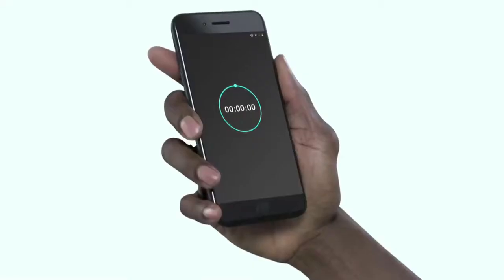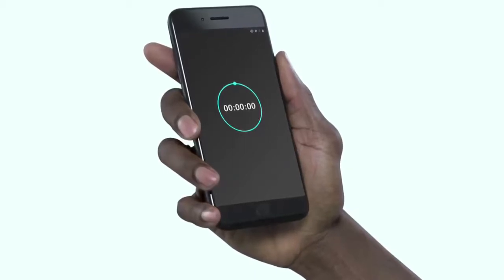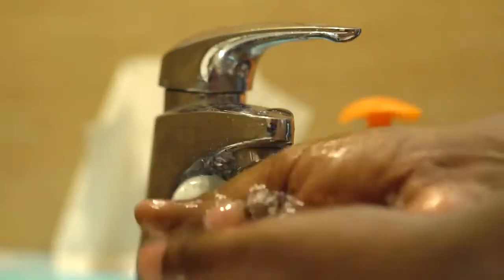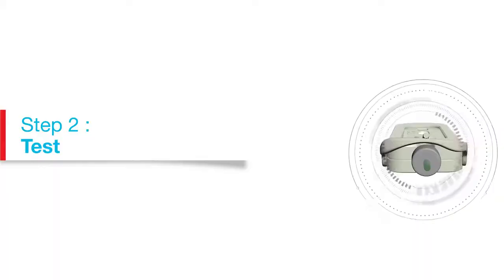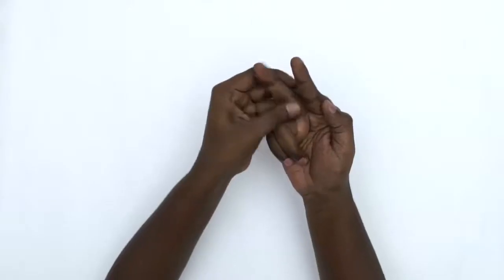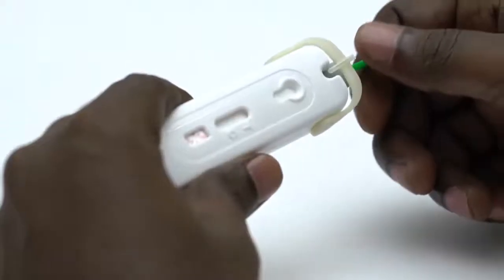You will need a timer to check the test results at the right time and correctly interpret them. Now wash and dry your hands to make sure they are clean. Select a finger and firmly massage it for 5 to 10 seconds to get the blood flowing.